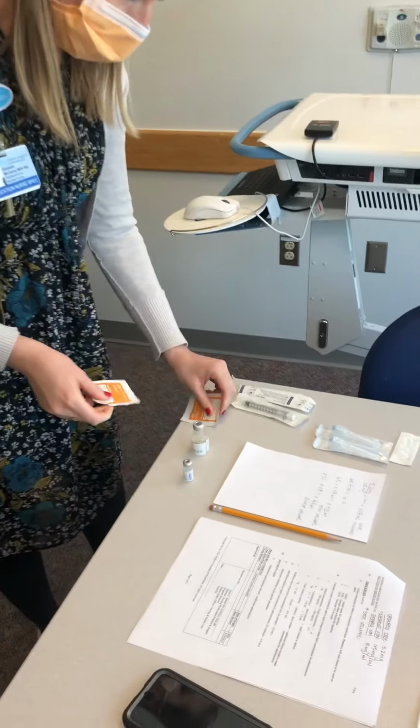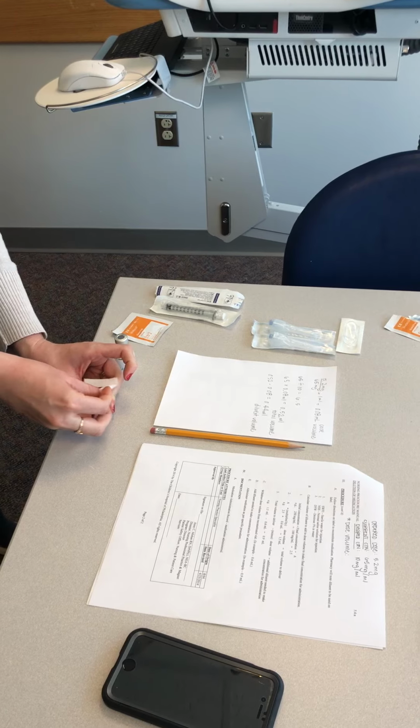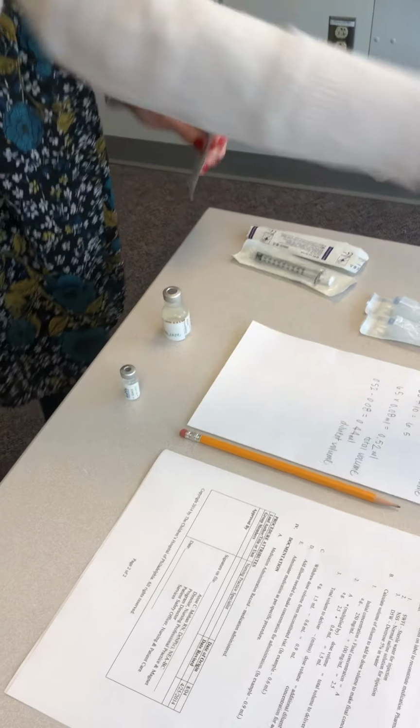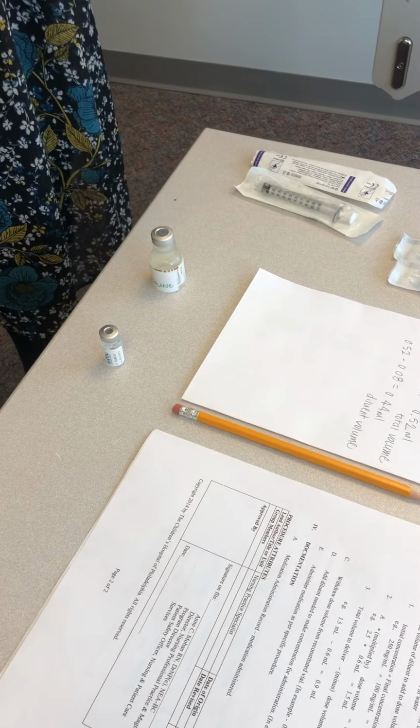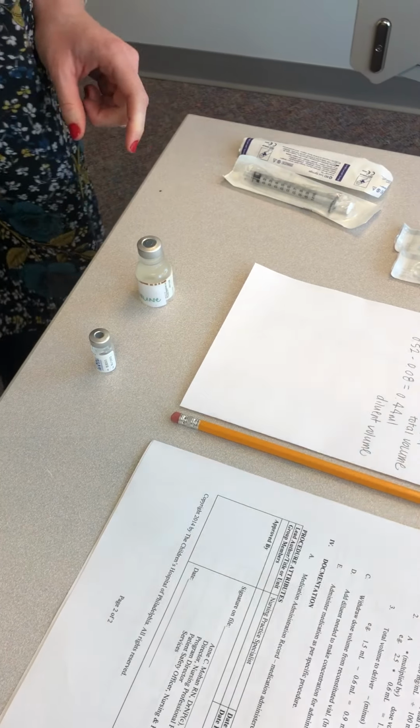Alrighty. So I have my Phenobarb and my normal saline vials. I will scrub for 15 seconds, allow it to dry. Scrub for 15 seconds, allow it to dry.